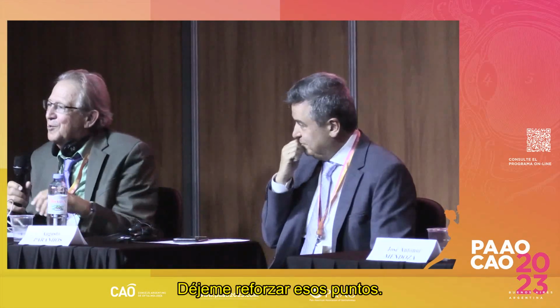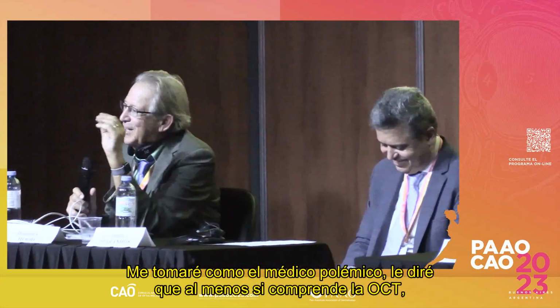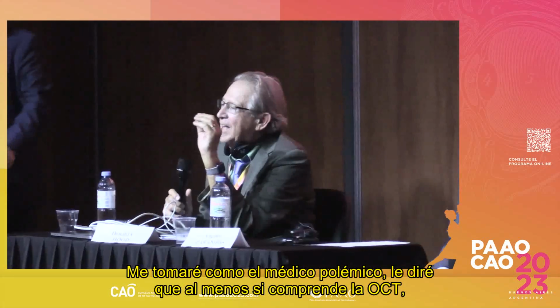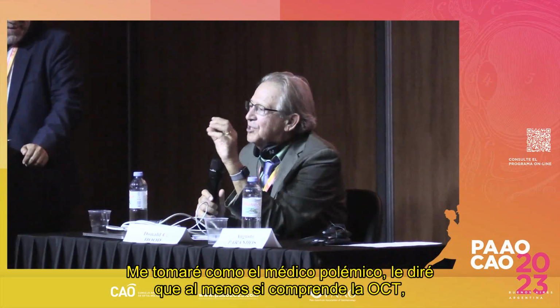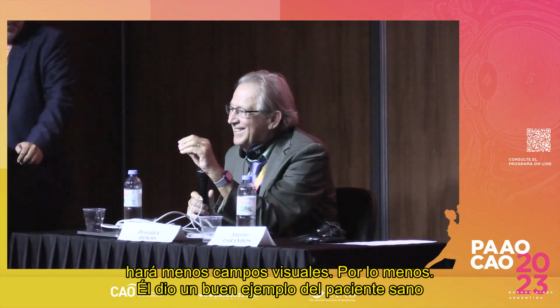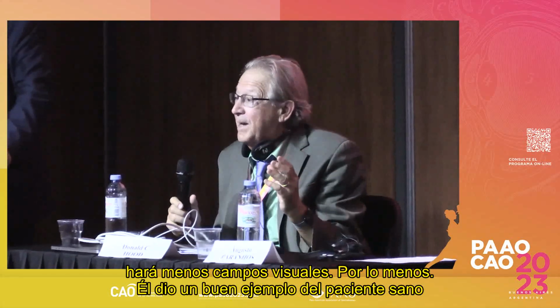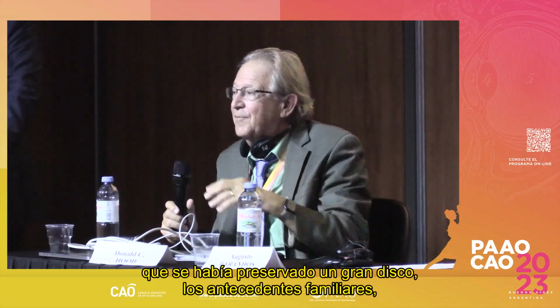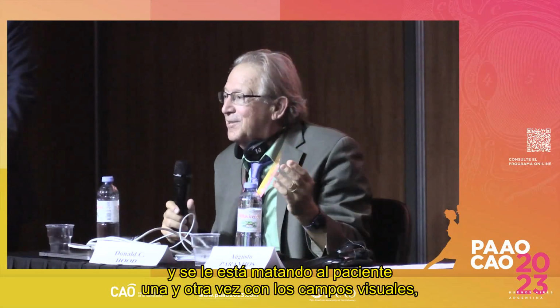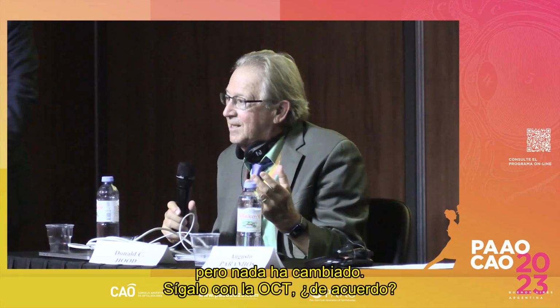Yeah, let me just reinforce those points. I'll take a non-controversial position at first and say, at the very least, if you understand the OCT, you'll be doing fewer visual fields. At the very least. And you just gave a good example of the healthy patient who happens to have a big disc and a family history, and you're killing that patient over and over again with visual fields, but they have never changed. Follow with an OCT, okay?